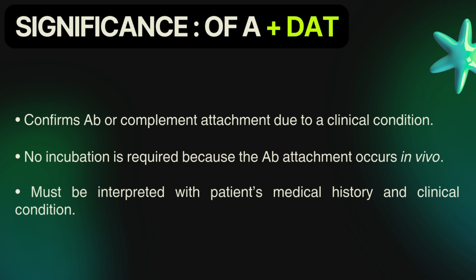Yeah. So it's important to note that unlike other tests, no incubation is required here because the antibody attachment occurs naturally inside the body, or in vivo. So this makes the test more straightforward and less time consuming. And finally, always interpret the results of a DAT in conjunction with the patient's medical history and current clinical condition.